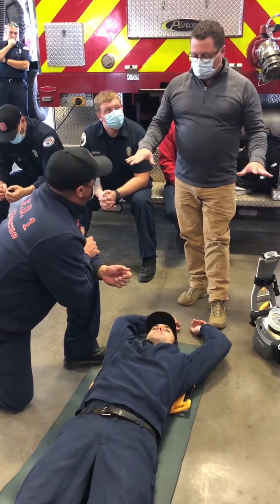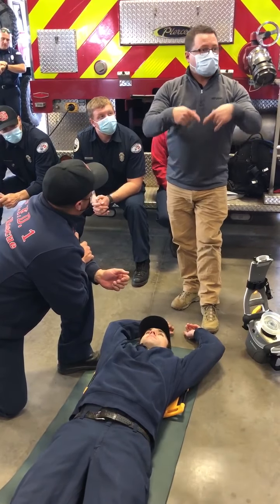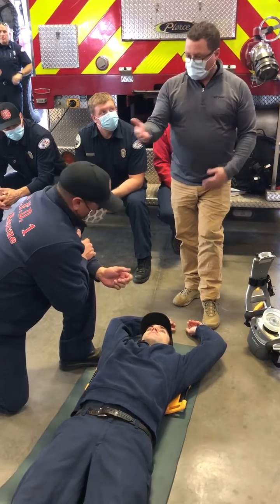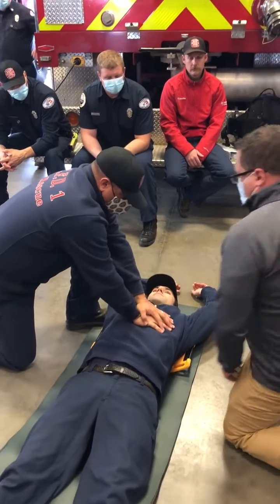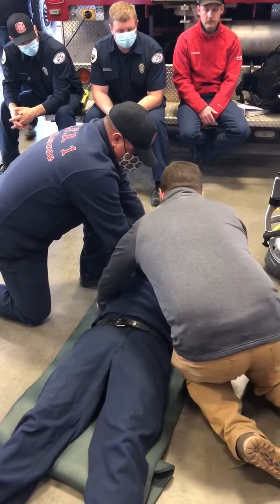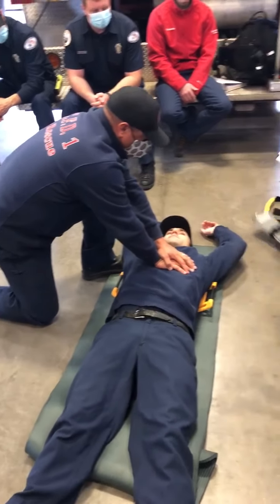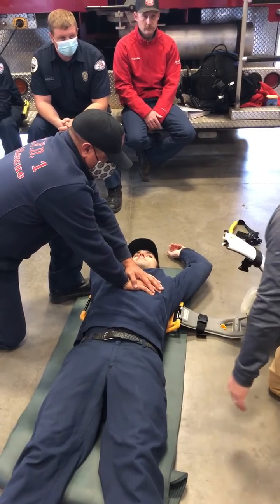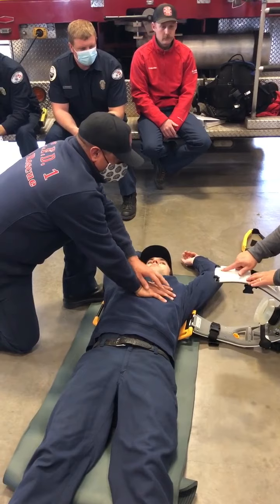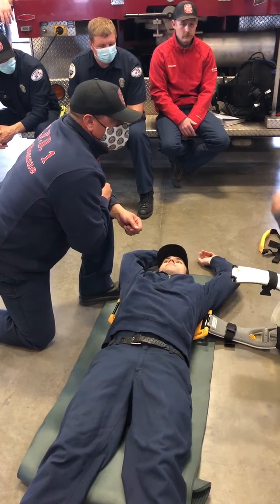There's no rush in this process, because now this was at our break at minute 4. I've now got 2 more minutes to set Lucas up, right? So as he's going, I'm going to look at placement. So put his hands on his chest. I want to make sure that his back plate is in a good spot, a spot that I'm going to have access to. I'll come into the side, get it clicked in, okay? And then I'll leave it open. Now, I like to use that yellow target as my target through his arms, okay?